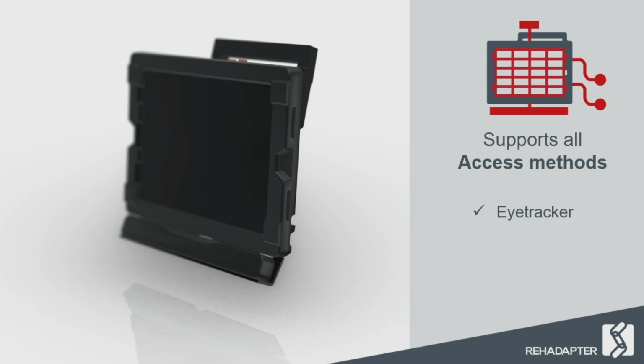One of these solutions could be an eye tracker, and as you can see here on the right side, attached already on this mount, we have found a solution for the Rehadapter Pro in combination with an eye gaze bracket to support one of the possible mobile eye tracking cameras, for example from iRespond, to access the iPad Pro 11 in combination with an eye gaze camera. The bracket itself can be installed below the Rehadapter on some prepared positions.